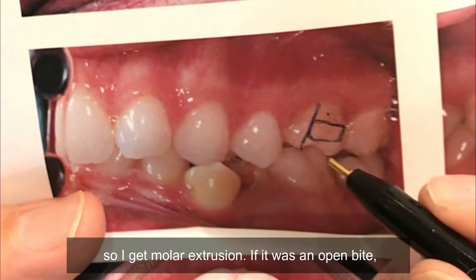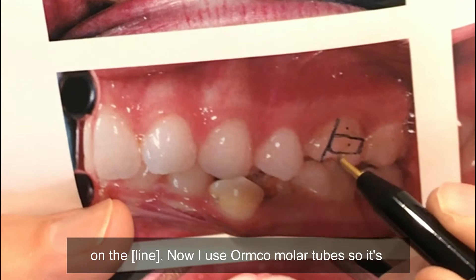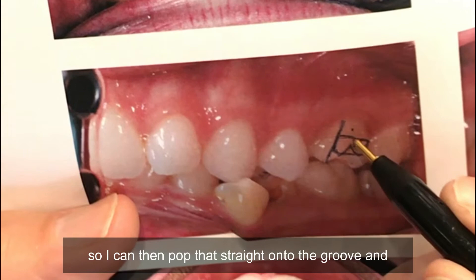If it was an open bite, I'd put that molar tube more occlusal. But whether I put it there or there, the rotational control is based on the same principle. Now I use Ormco molar tubes, so it's easy for me — they have a little groove here so I can pop that straight onto the groove, and most times we get it right.